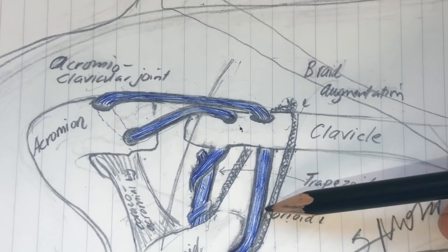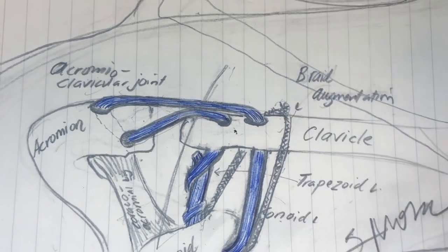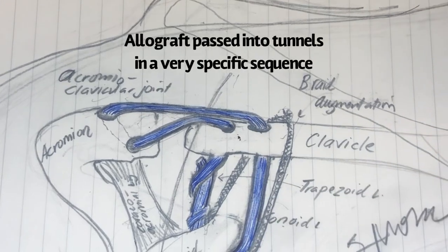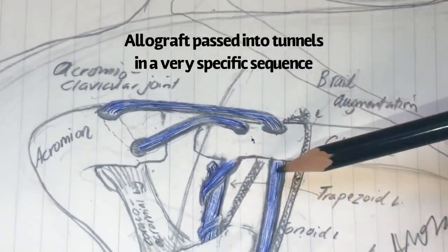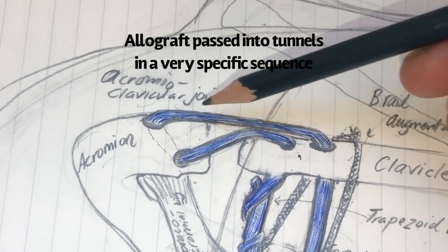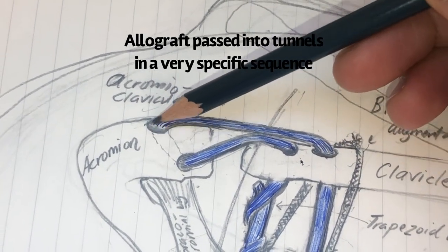Once I pass the tendon in the braid, I tie the braid down. The clavicle is now held down. And then I take this limb of the graft and pass it through the tunnel from under to over. And then I go through the acromial tunnel from over to under.